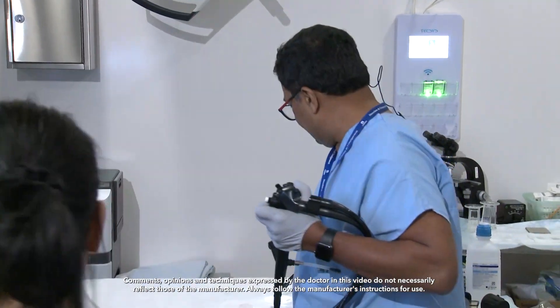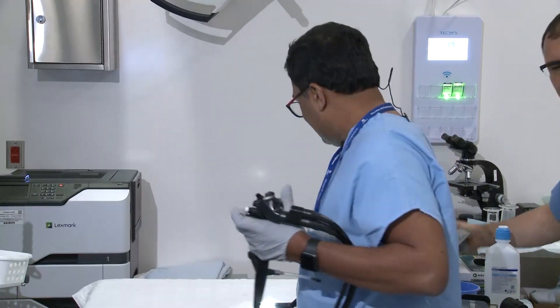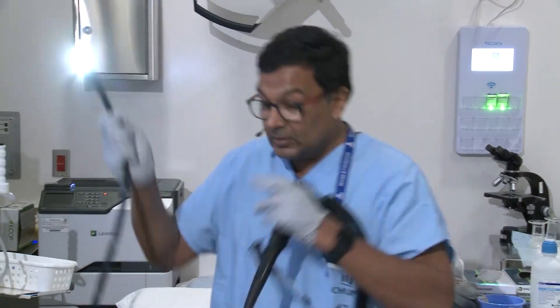So this lady has some pain and something wrong with her pancreas. I think it's a stricture or some atrophy or something. So we'll try and see what's going on.